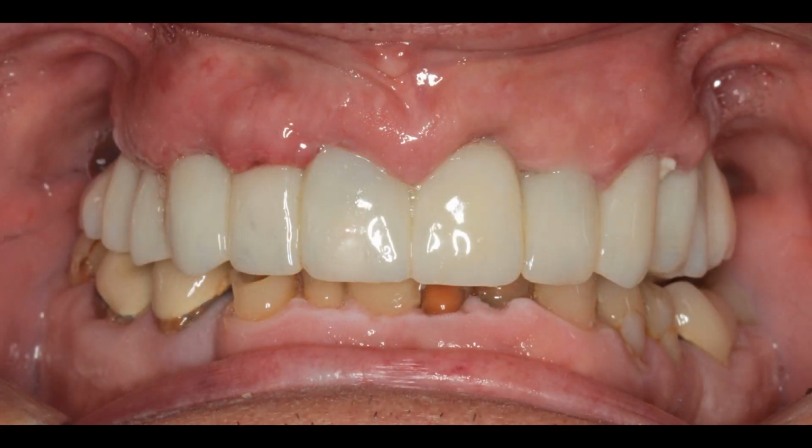Every once in a while we have patients who come in from out of town that like to stop by the office the next day just to get a checkup before they fly back out of town. But I'm always amazed when you do minimal bone removal surgery and you're careful with your implant placement and careful not to disturb the tissues, well, just say as little as possible. This is what it looks like in 24 hours.